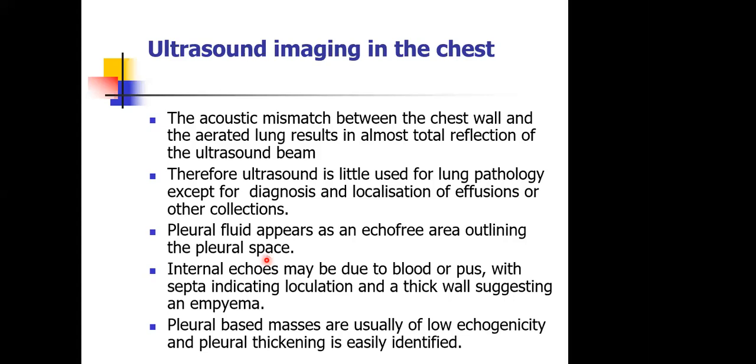There's a lot going on in children, trying to see if we can adequately use it to diagnose things like pneumonia in children. And it's becoming a mainstay, especially in emergency units. Some of you have already heard about point of care ultrasound scan. So it's being used a lot in emergency units now to pick out some pathologies that physical examination would not adequately reveal.